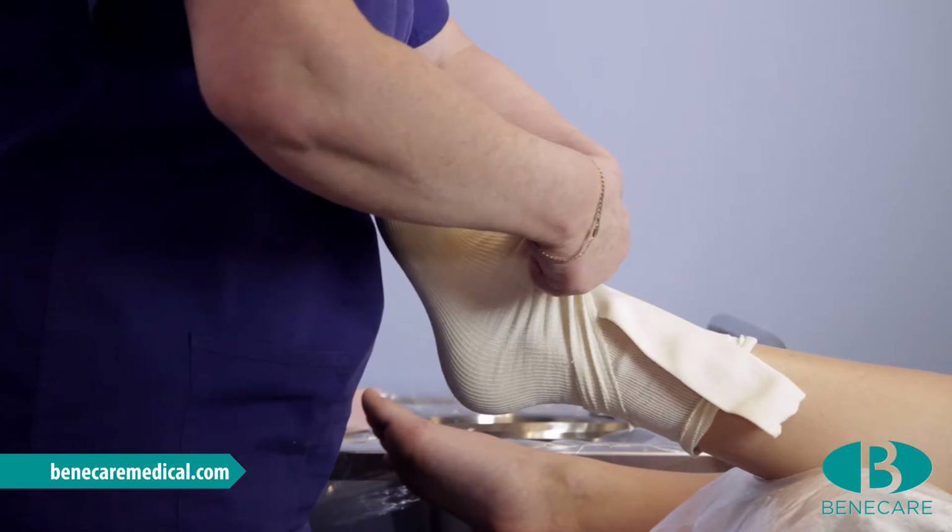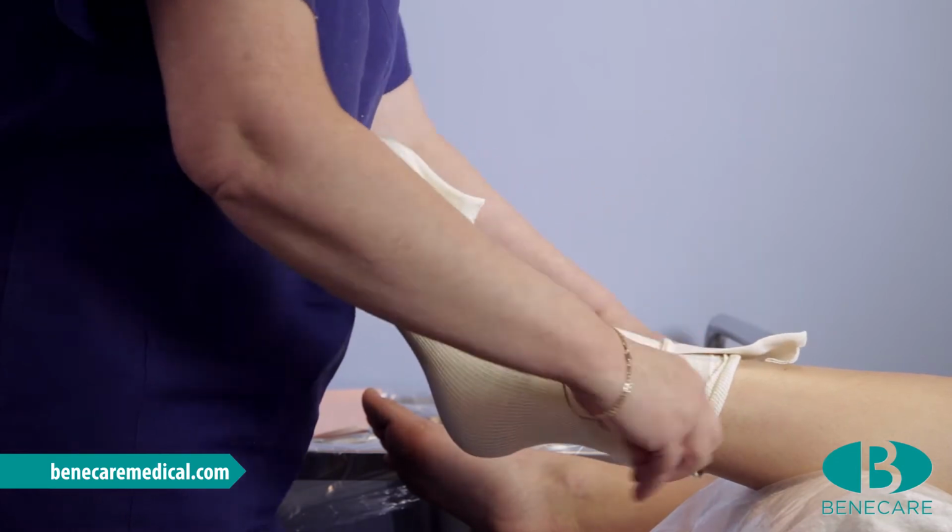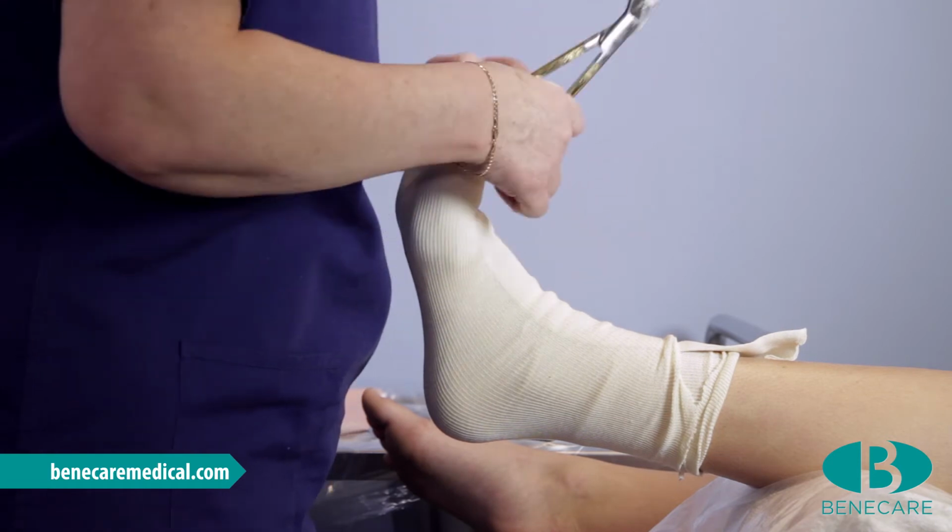Position the third layer of stockinette along the dorsum of the foot for safe removal of the cast. Trim away any excess stockinette.